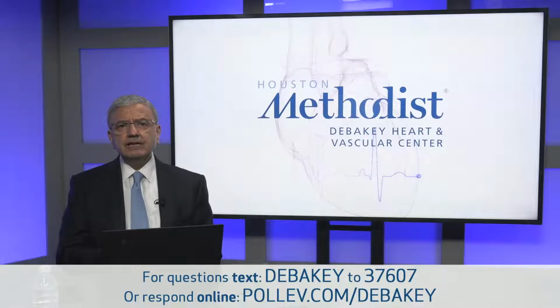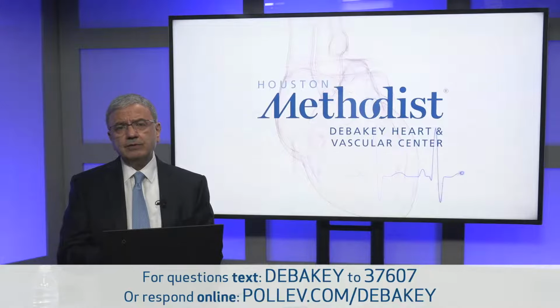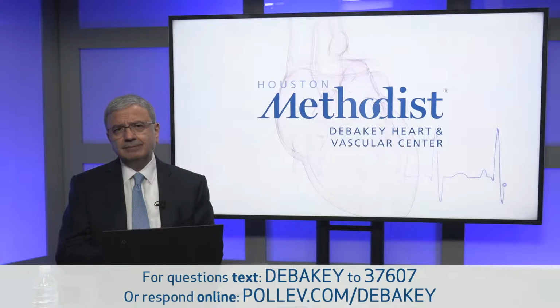Can dextrose-containing solution be used for better visualization? I'm not sure about this question here, but if you talk about agitated saline or any other solution, you could agitate almost anything. You could agitate the saline solution, a dextrose-like solution. You could add a little blood. Actually, in the early days, that can enhance the microbubbles that you produce by agitation. So any of these, I think, would do.